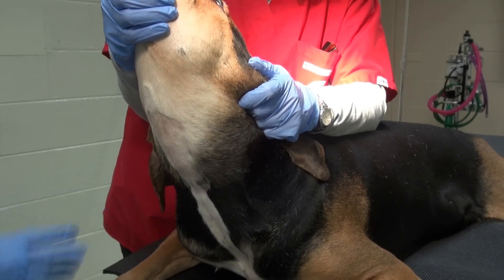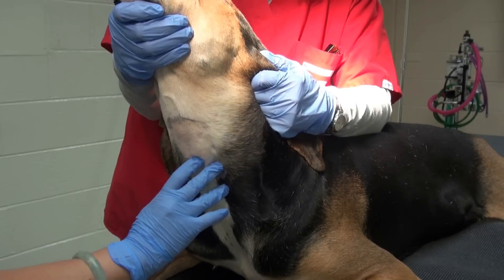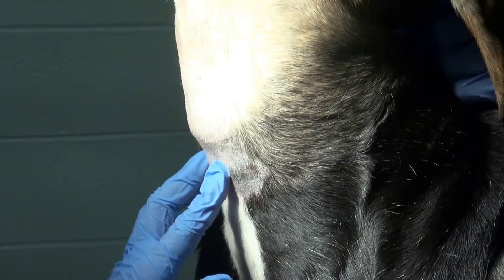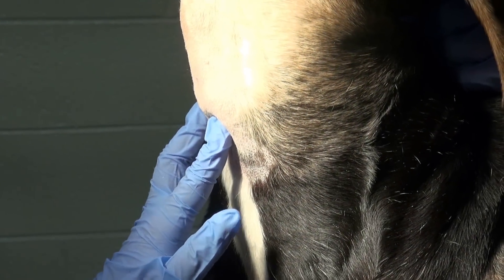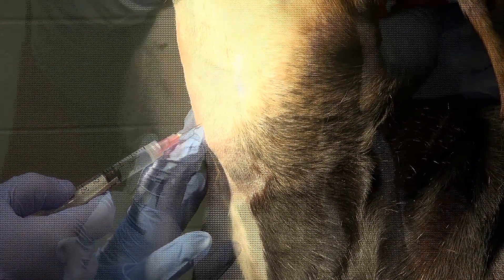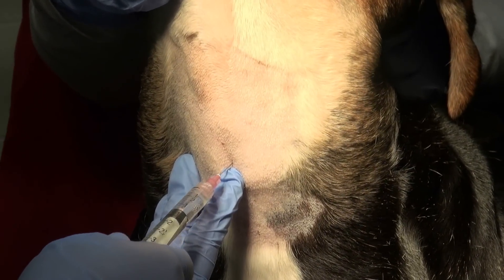After wiping the excess hair and dander from the skin, we proceed with a lidocaine block of the cricothyroid ligament. Holding the syringe in your dominant hand, use your other hand to palpate the trachea and work your finger up to the cricoid cartilage. Place your index finger on the symphysis between the left and right halves of the cartilage, then guide your needle just over your fingernail through the skin and into the cricothyroid ligament.